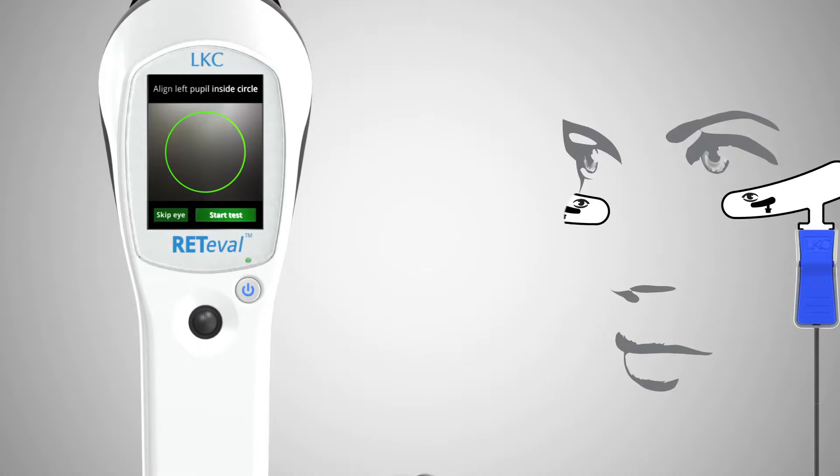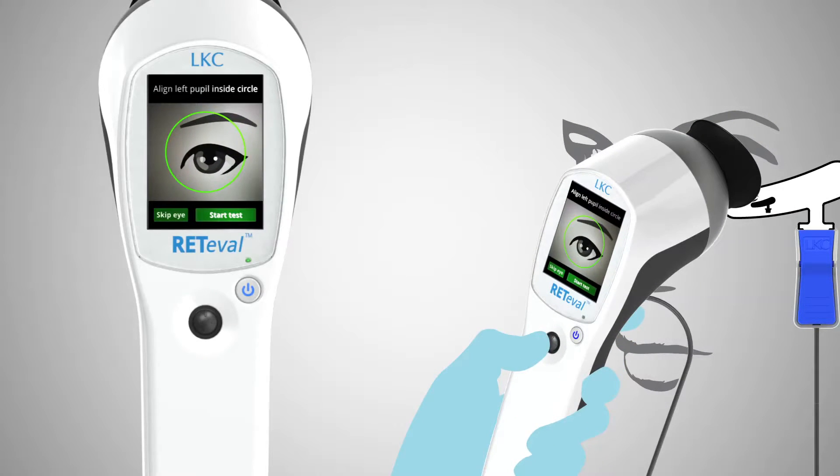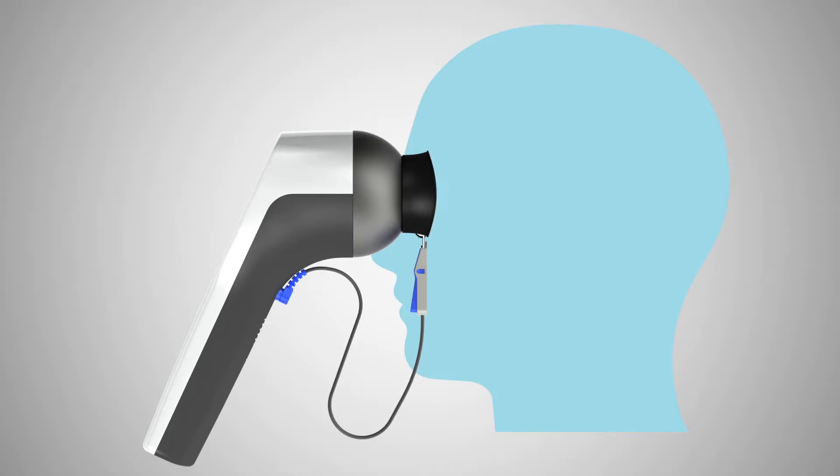Position the device over the patient's eye under which the sensor strip is connected. Ask the patient to look at the red fixation LED and, using the live video provided by Reteval as a guide, position the pupil of the eye within the green circle shown on the display. Press start when properly positioned, and Reteval will start flashing light into the patient's eye.